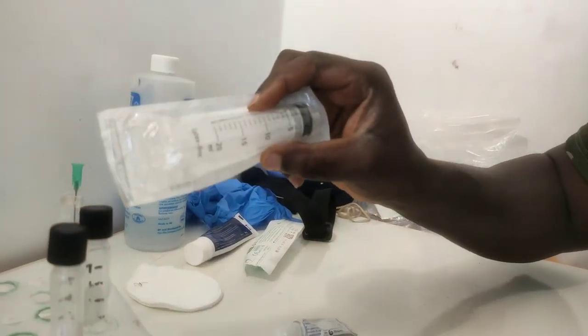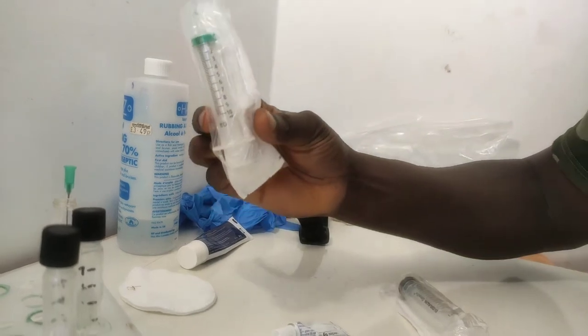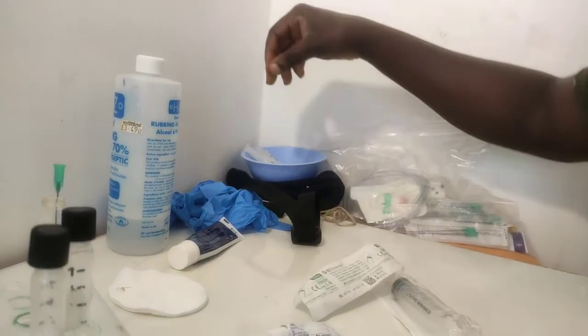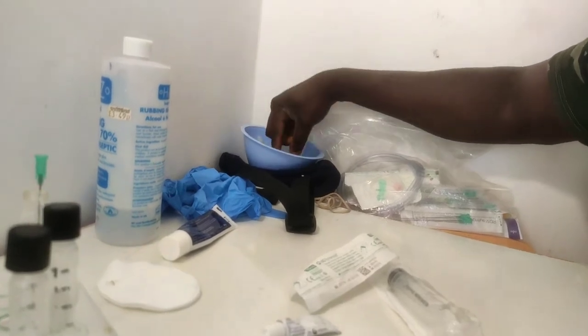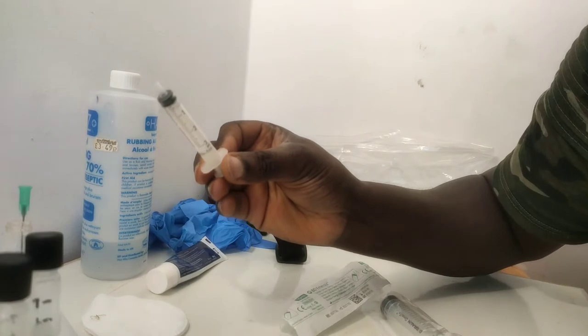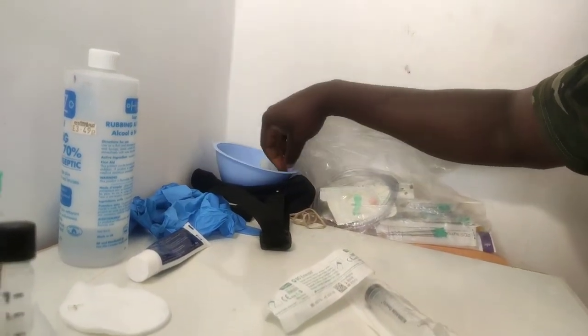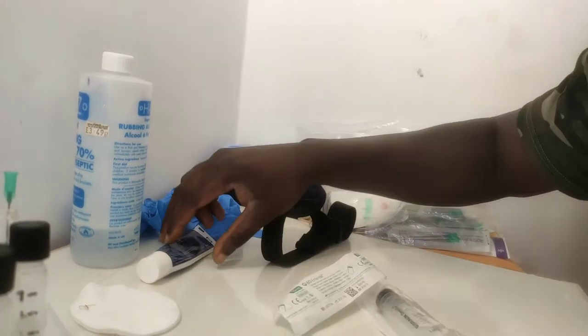I got my 20ml syringe. I got a 10ml here — I think I got another little one somewhere — and a tiny one here, 3ml. It's all been sterilized. Yeah, so I got all those in, use this for my arm.